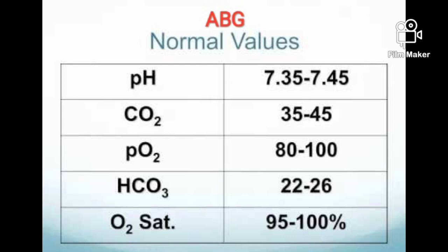Metabolic acidosis with metabolic alkalosis, the pH is in the normal range and the bicarb is normal. This happens in uremia or ketoacidosis with vomiting, nasogastric suction, and diuretics.